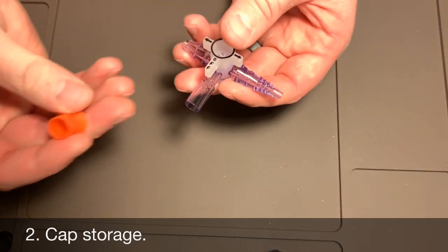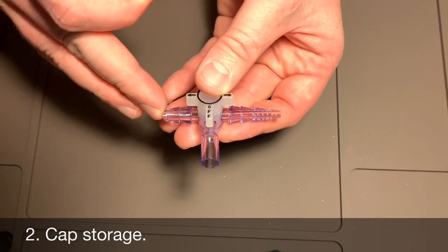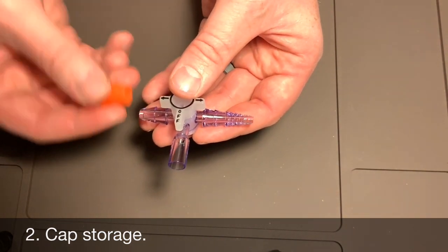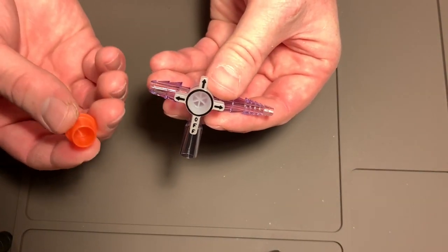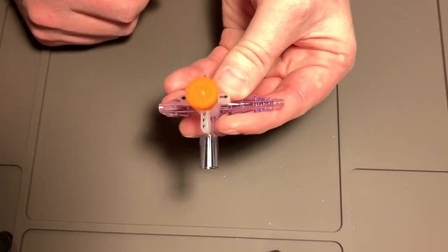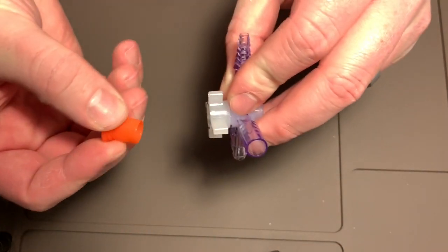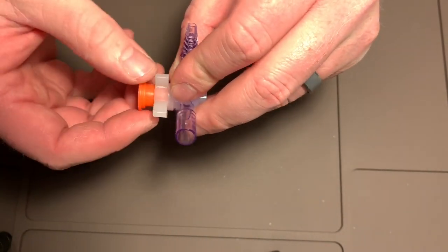Tip number two is whenever you take this cap off to put your medications in, you end up losing this cap a lot. Well, this actually sits right inside your dial right there. So that way you don't have to worry about losing it or dropping it or misplacing it.